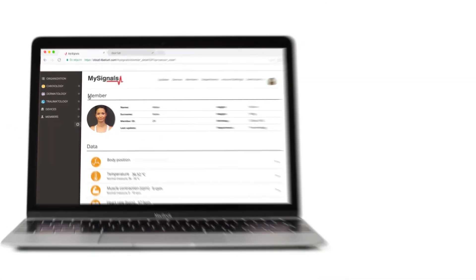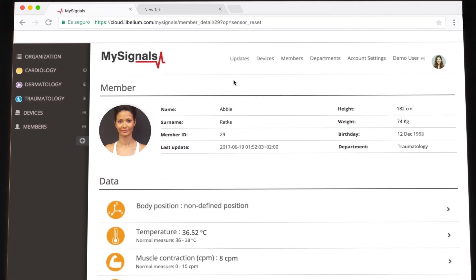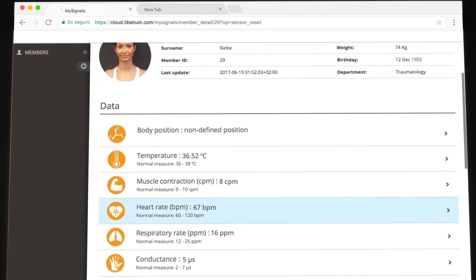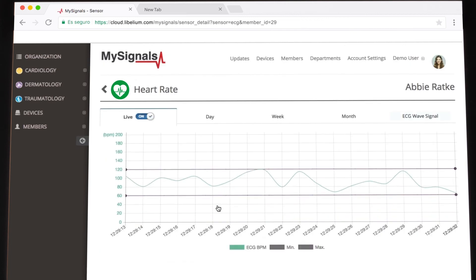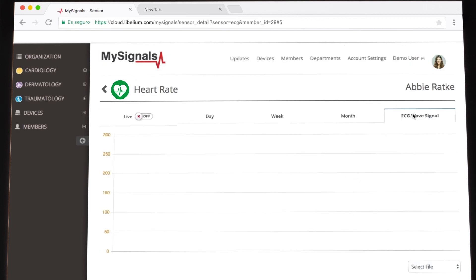Access the sensor inside the MySignals cloud. Click on the Sensor Wavesignals tab in order to see the data monitored in RAW mode.